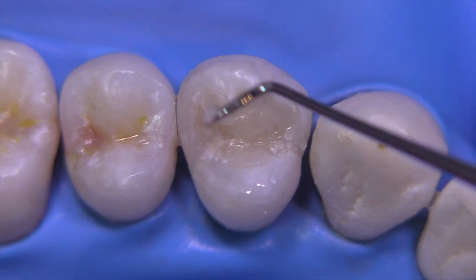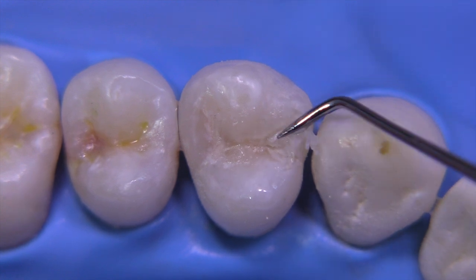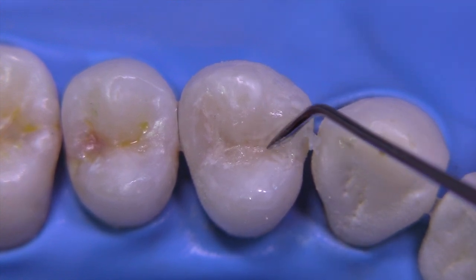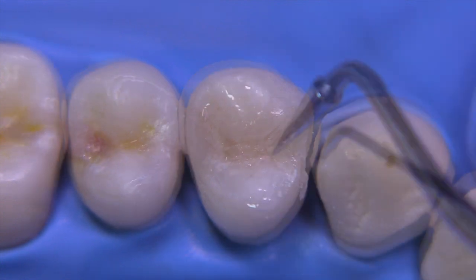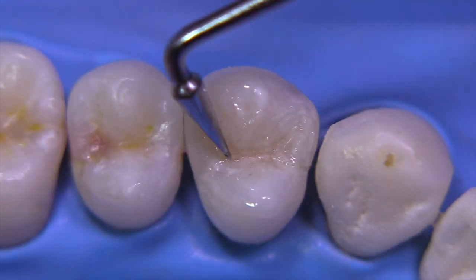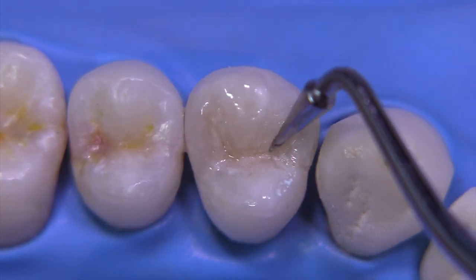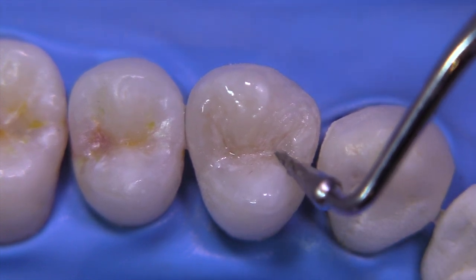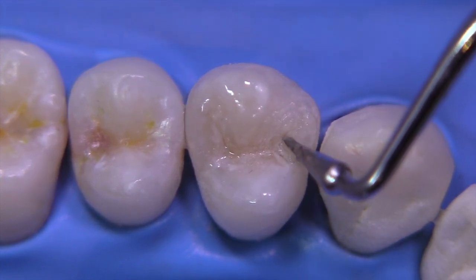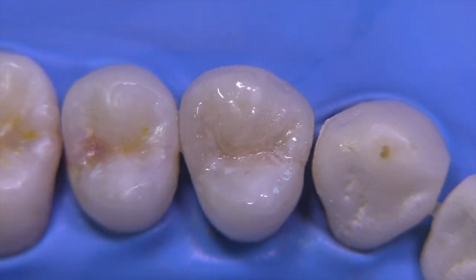All of that anatomy we placed is just being copied with this final layer. Any stains used underneath are deep down inside and would just barely show through, but they do create some minor effects at the final surface layer. You can see a little bit of the groove tint material showing through.